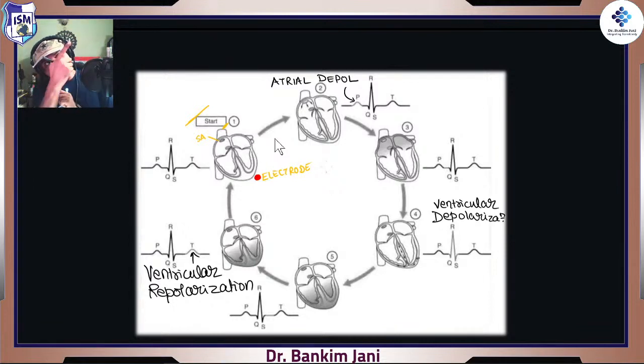You are watching from that point: the SA node fired. As soon as it fires, it will go tuck, tuck, tuck. This is the right atrium, which will be charged. And immediately, through Bachmann's bundle, it will charge the left atrium also. So they both are charged. When the current is going, it is going towards you. You are sitting and watching from this point. So that's the P wave.